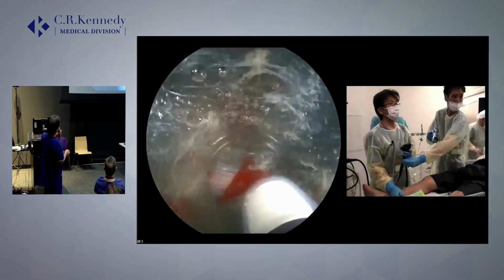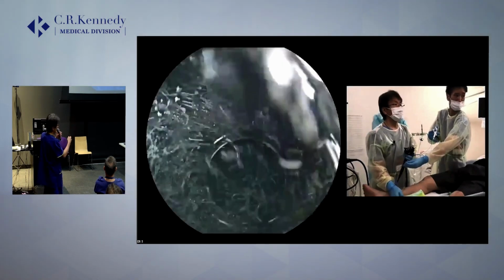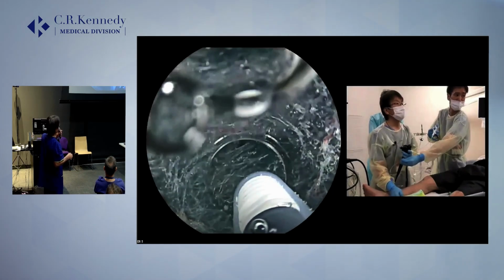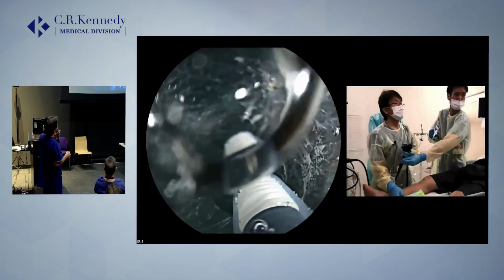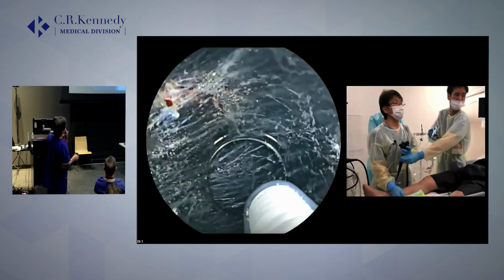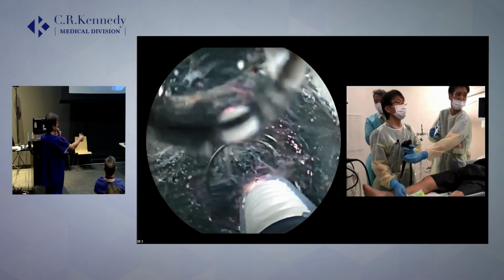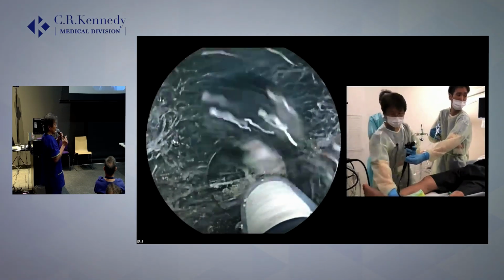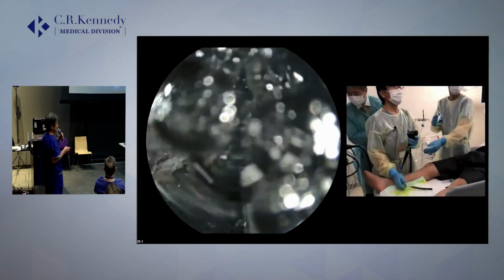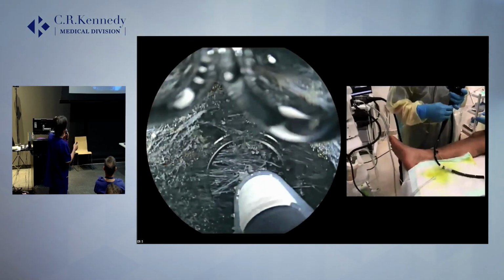And even if there is some bleeding, the blood can be washed away by the flow from the flash knife, and the drainage of the saline is through the overtube of the double balloon endoscope. So just one-way flow. The bleeding or bubble formation makes the ESD procedure difficult. But as long as you don't use suction, it just goes away.